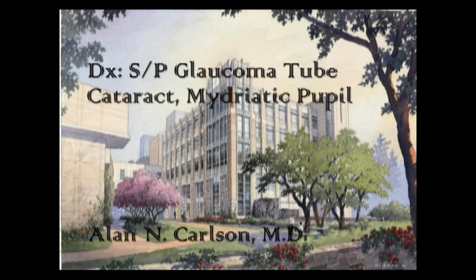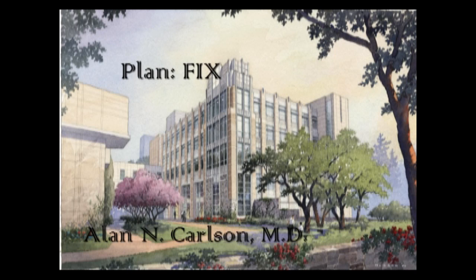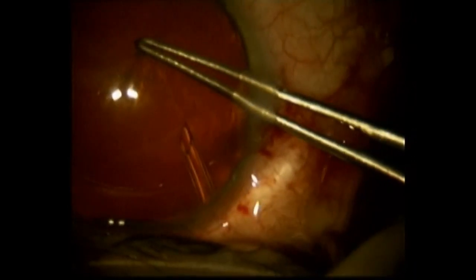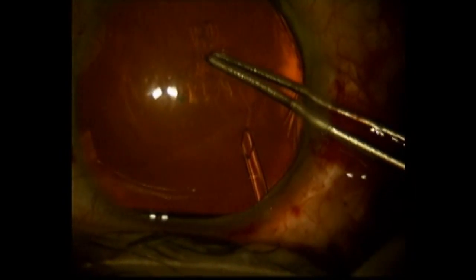This next patient is a patient who's had previous surgery related to glaucoma, resulting in permanent dilation of the pupil. This is actually an undilated pupil showing significant mydriasis, or permanent dilation.